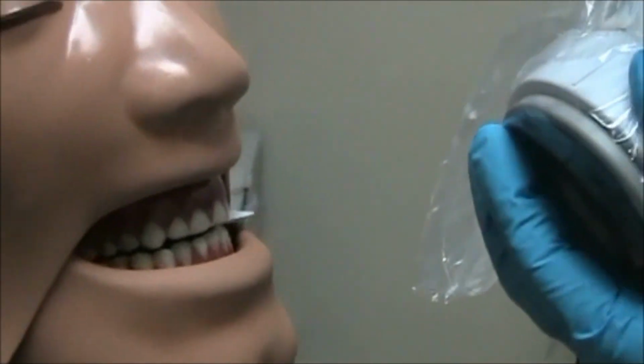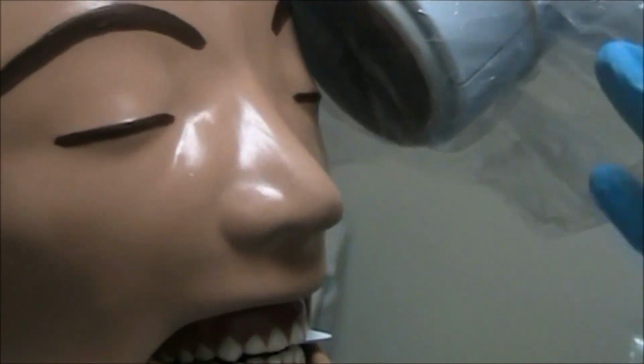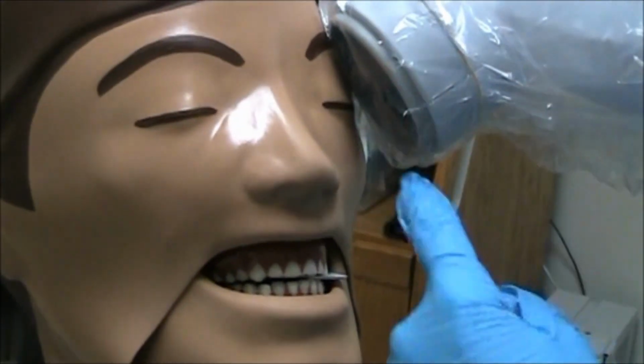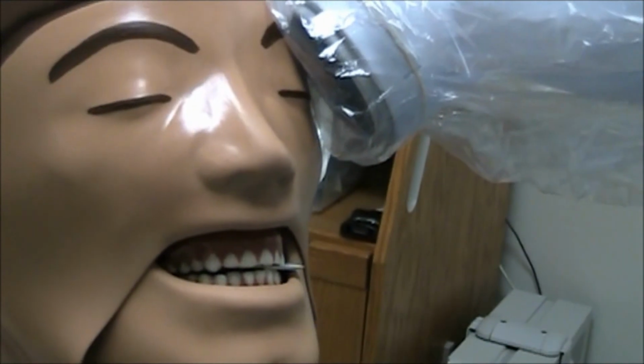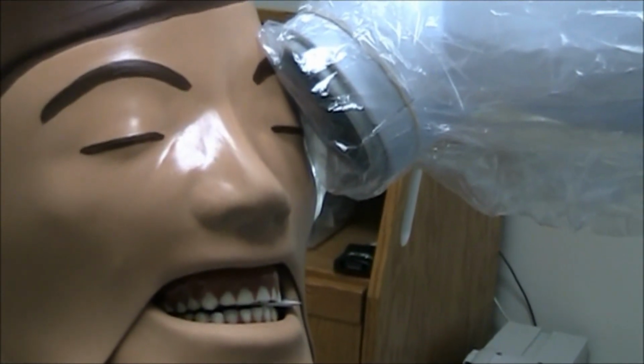The long edge of the receptor should extend approximately a half inch beyond the buccal surfaces of posterior teeth. So the PID is directed at positive 60 degrees in vertical angulation towards the center of the receptor. The top edge of the PID is placed above the corner of the patient's eyebrows.